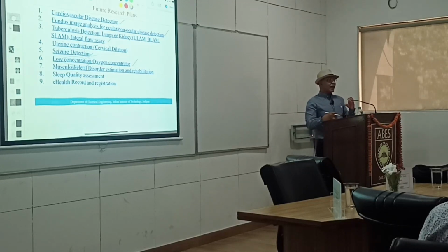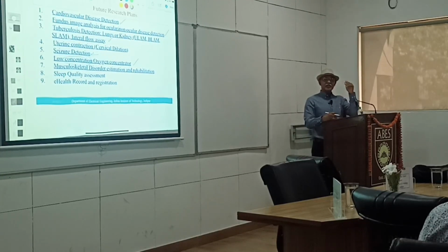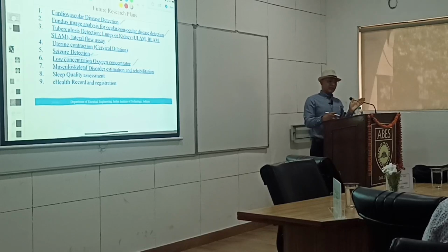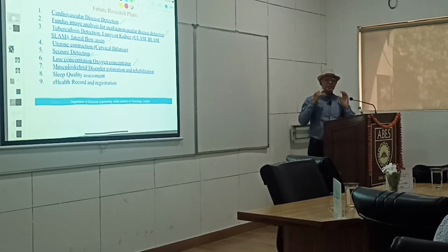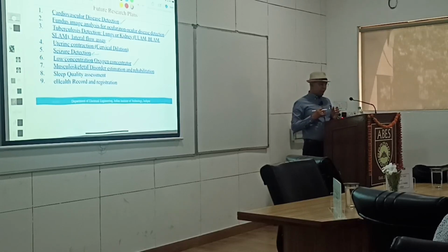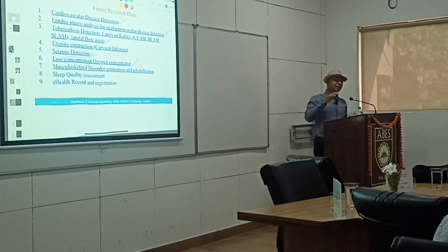So people say they want a very high flow rate, right? And a higher oxygen concentration, 93, 94%. In fact, higher concentration will limit the flow rate. So if you can manage with a low flow rate, then you can have higher concentration, and vice versa. Now the question is, do you really need 93, 94% concentration of oxygen all the time? No.